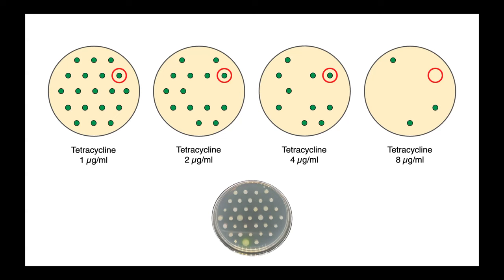Following that overnight incubation, you can see that colonies have formed on some plates, but not all of them. And by comparing where we get growth and where growth is inhibited, we can determine an organism's minimum inhibitory concentration.